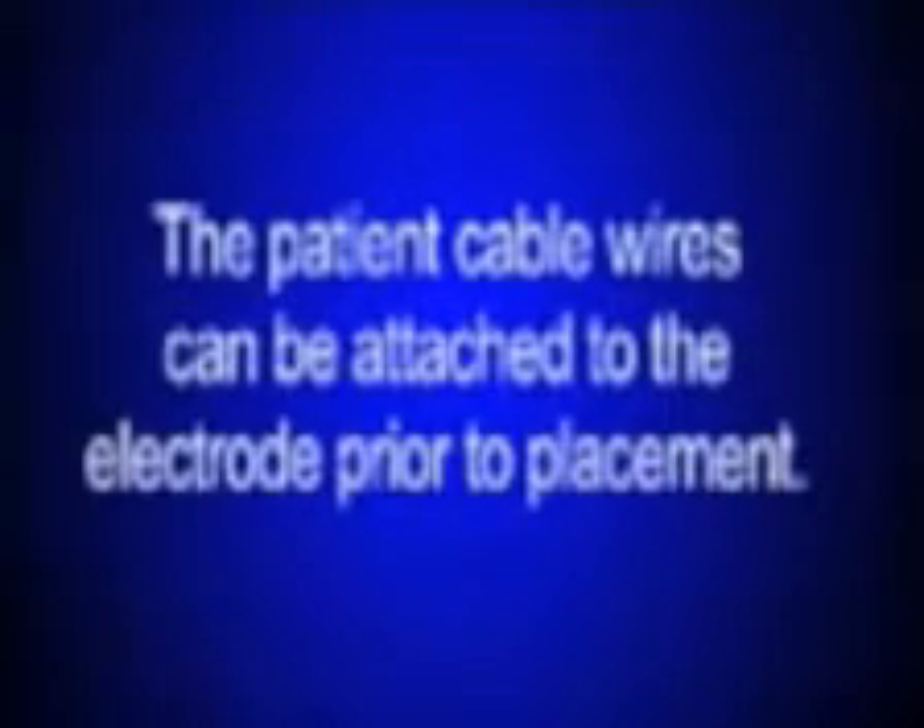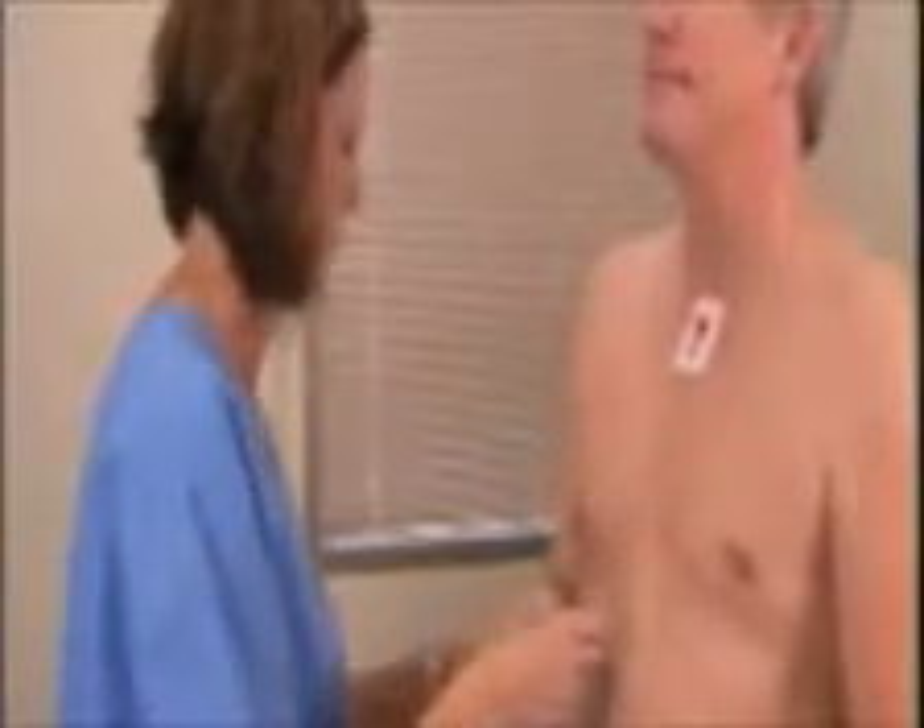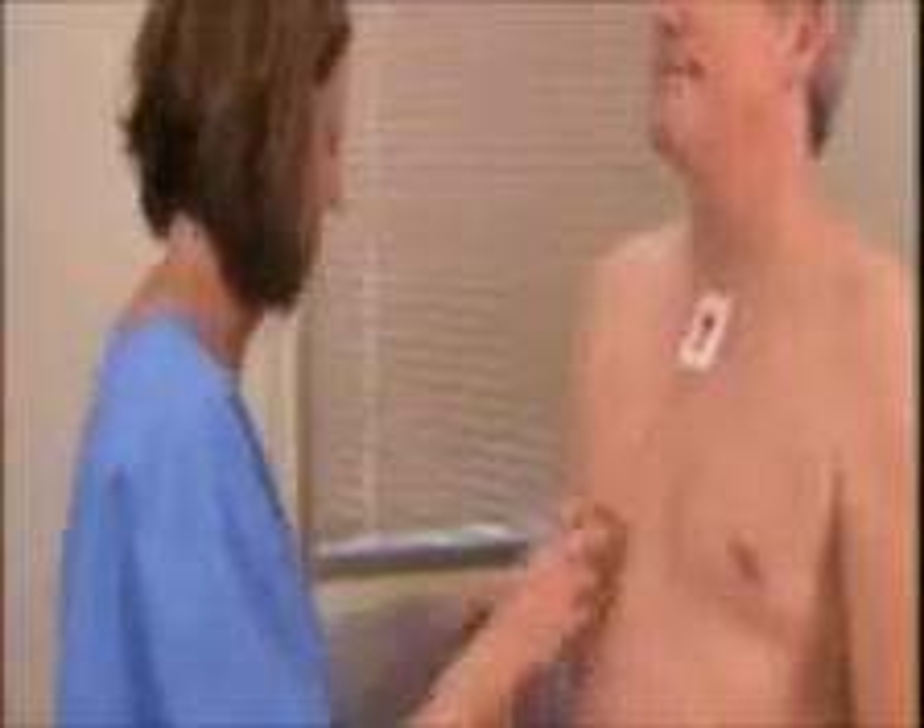Once all electrodes have been put in place, you are now ready to attach the patient cable wires to the electrodes. To avoid too much pressure being placed on the center of the electrode, the patient cable wires can be attached to the electrode prior to placement. Attach the patient cable wires to the electrodes according to the color coding indicated on the diagram of the IQ Holter Quick Reference Guide.